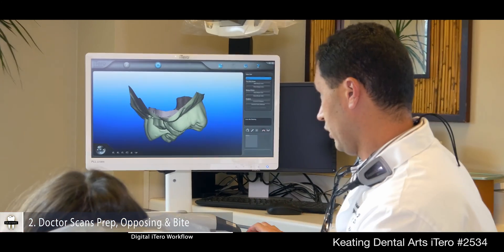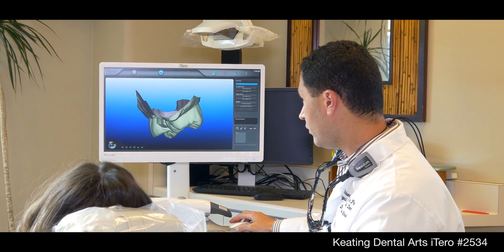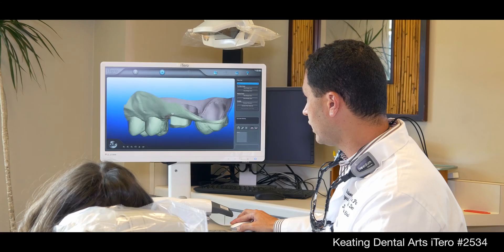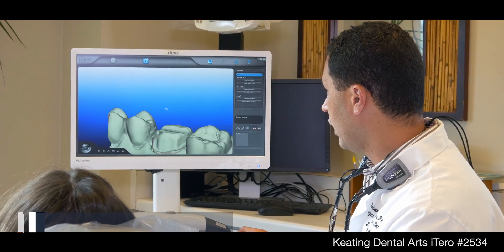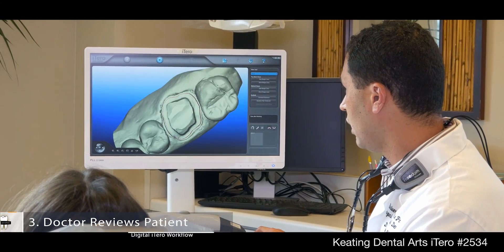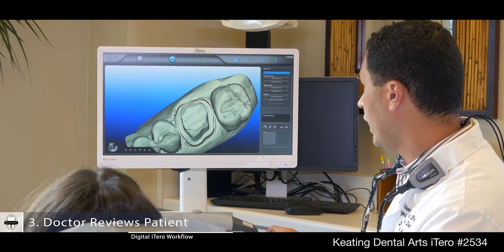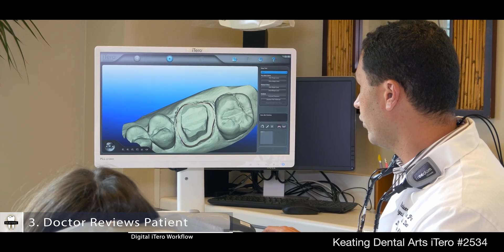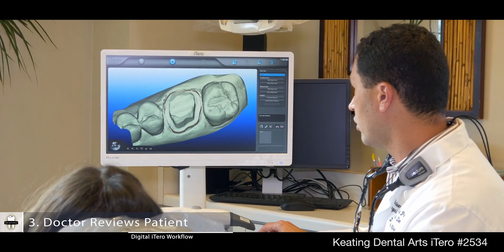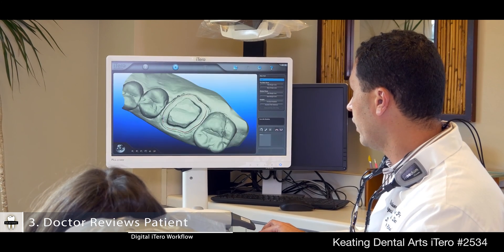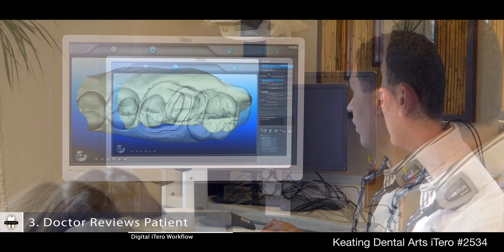All right, so we're done with the scan right now. This is the actual tooth that we scanned — the prep — and you can move it around, just make sure you captured the margins correctly, the anatomy and so forth.